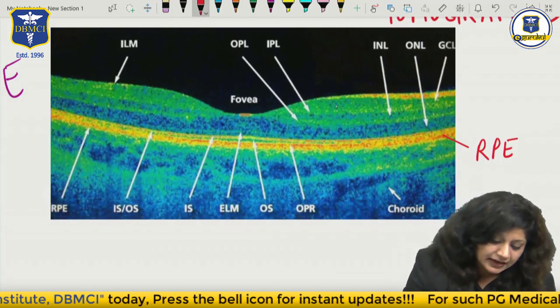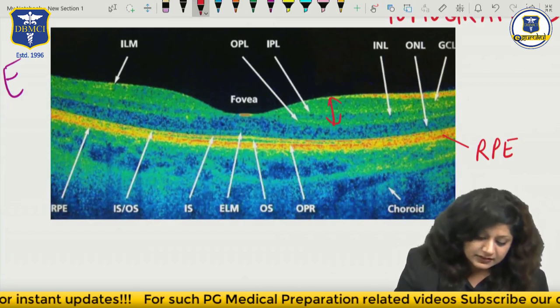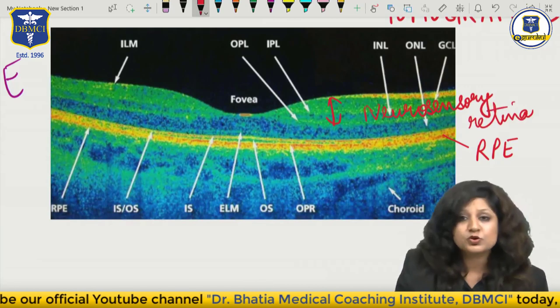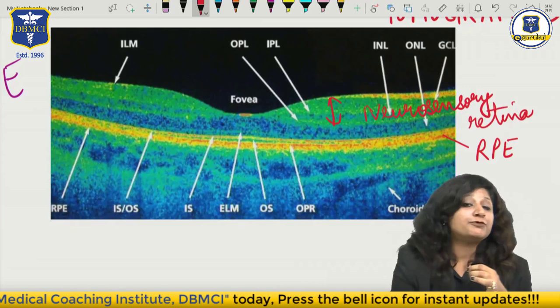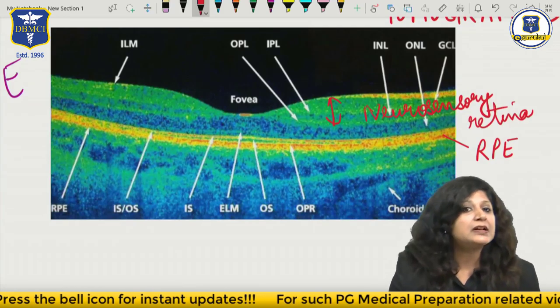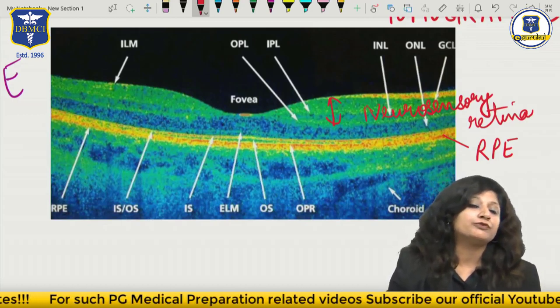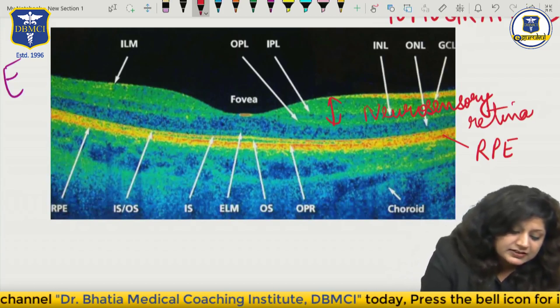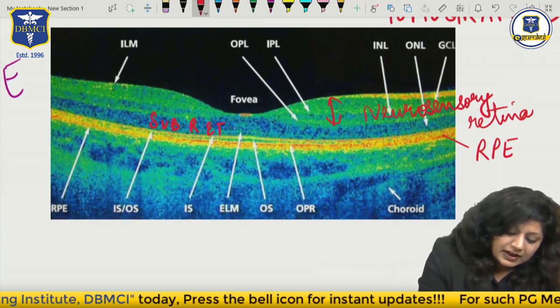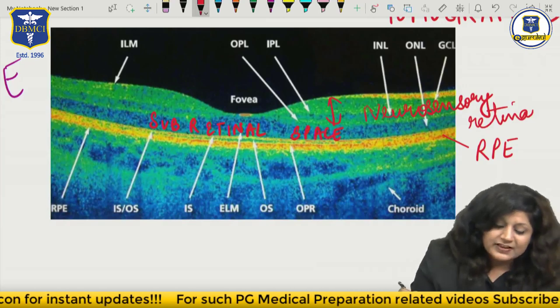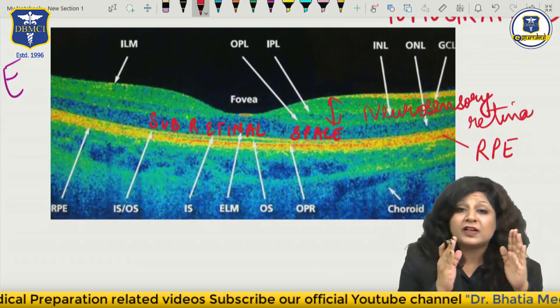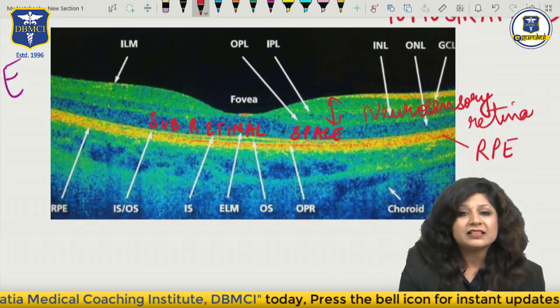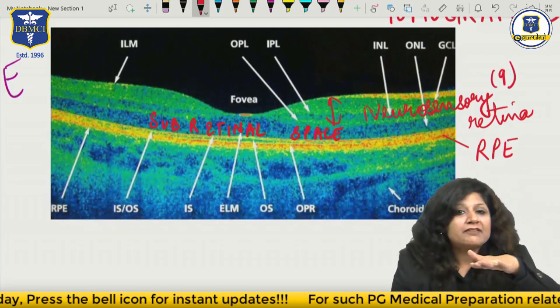Then you can see this green area. This green area is what you call the neurosensory retina. Let me remind you what the neurosensory retina is. The 9 layers apart from the retinal pigment epithelium are actually constituting the neurosensory retina, and we have a space in between the two. This space is called the sub-retinal space.